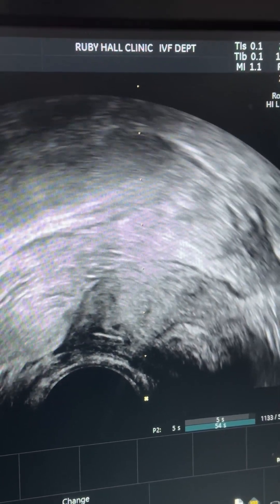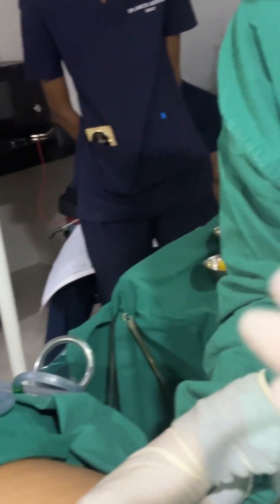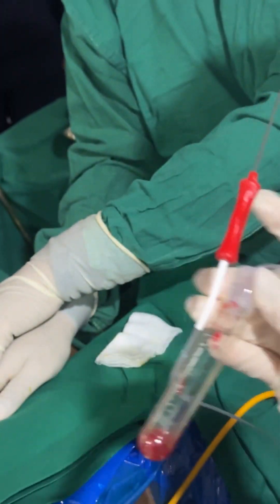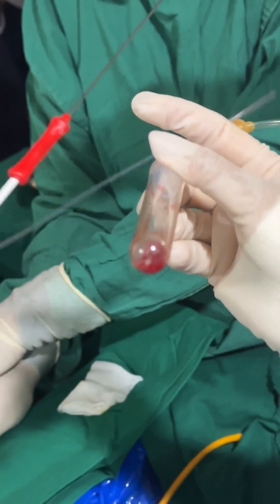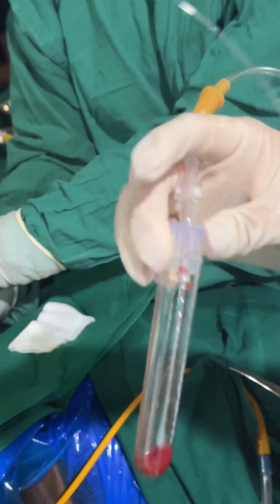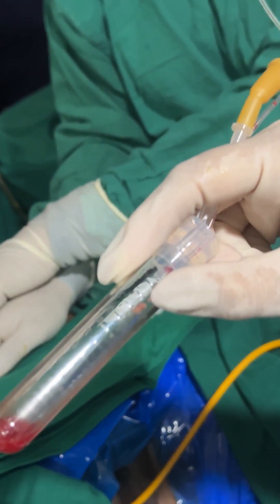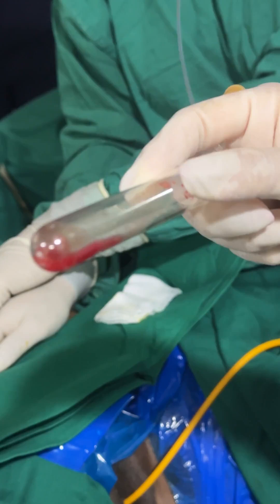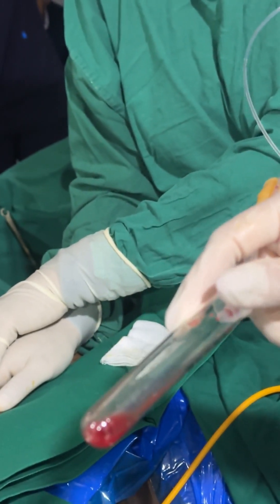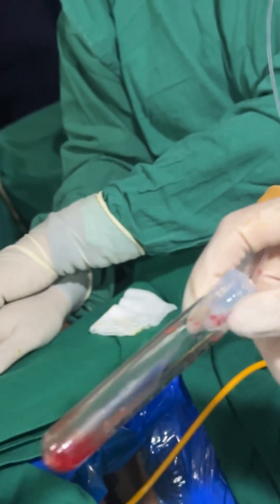Can you show the fluid we got, Dr. Rajesh? There is some amount of decidual tissue with blood. Show the decidual tissue here — can you focus on that? And there is decidual tissue even at the base. Can you see the decidual tissue in the tubing as well?